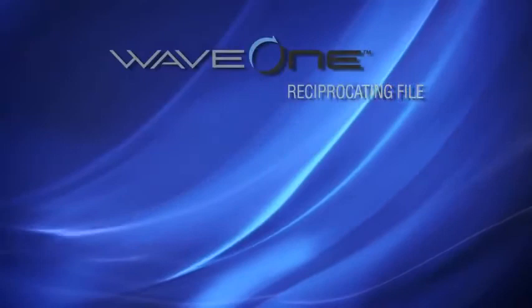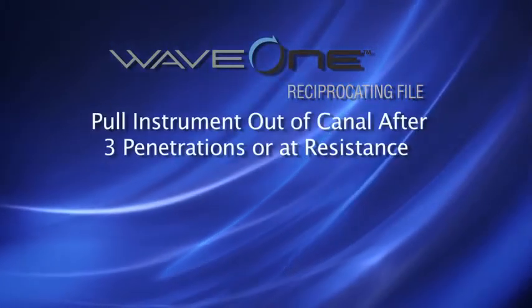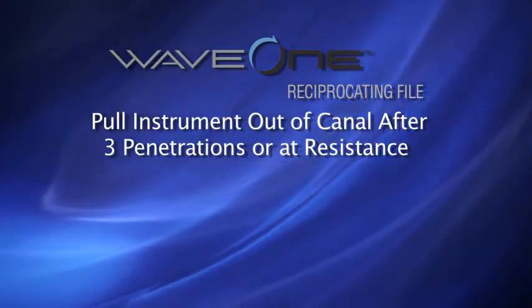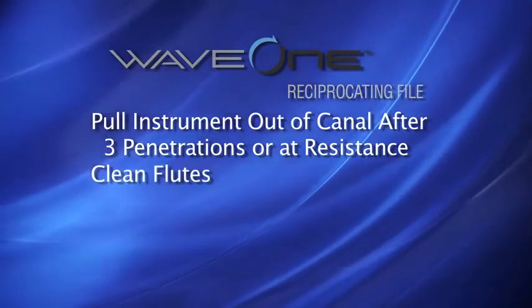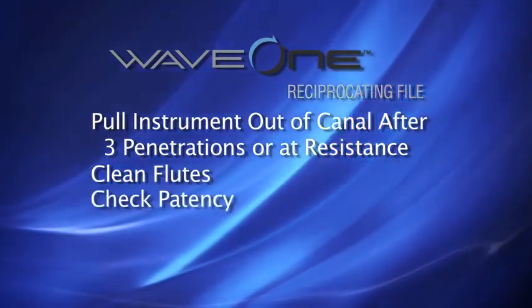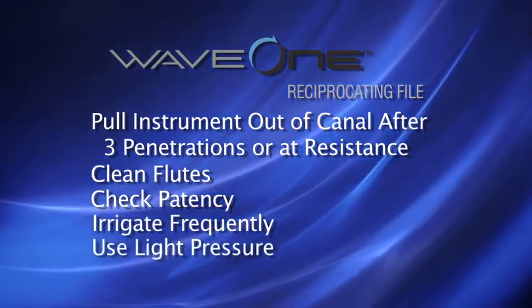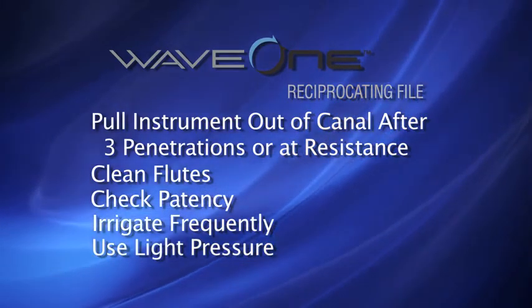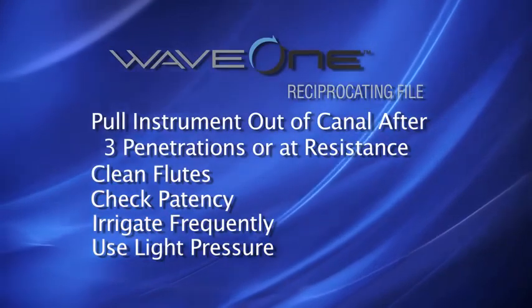There are a few key points to remember with the Wave 1 technique. First, pull the instrument out of the canal after three in-and-out movements or when resistance is encountered. Clean the flutes of the instrument and regularly check canal patency each time you irrigate. Do not apply excessive pressure if resistance is encountered. Instead, pull the instrument out of the canal, clean the flutes, check canal patency, and irrigate.